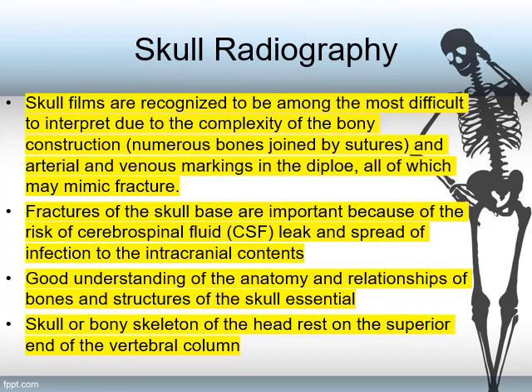So the skull radiography, or sometimes it is also referred to as skull films, is recognized to be among the most difficult to interpret because of the complexity of the bony construction and arterial as well as venous markings in the diplo, all of which may mimic fracture. So, ibig sabihin, ang skull radiography or ang skull films, one of the most difficult parts of the body to interpret, especially when it comes to radiographic examinations.